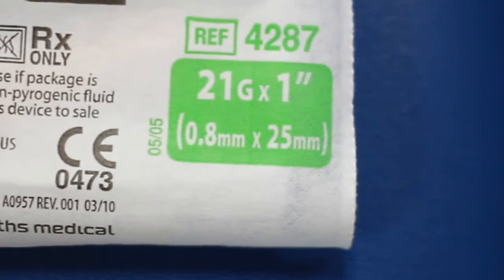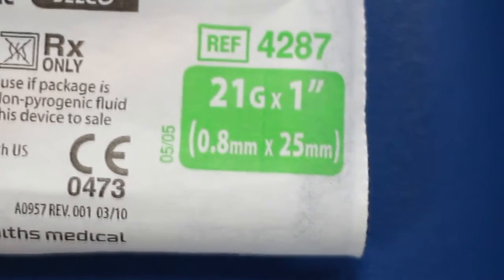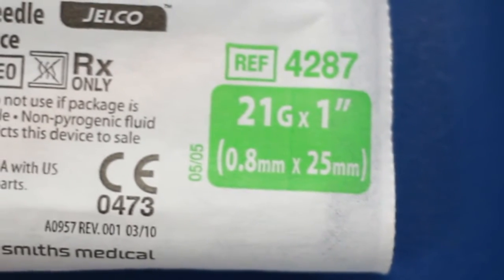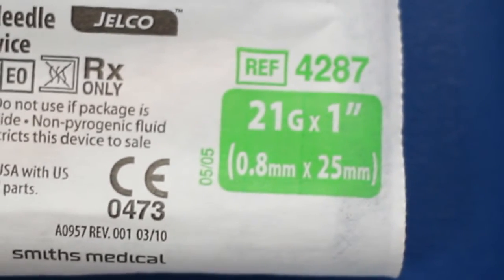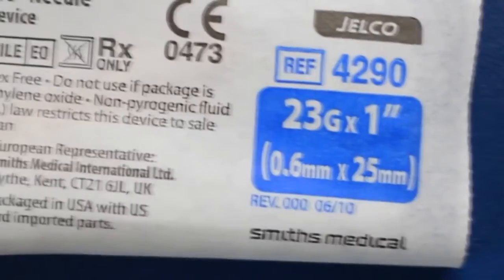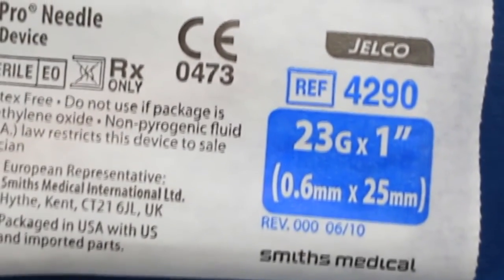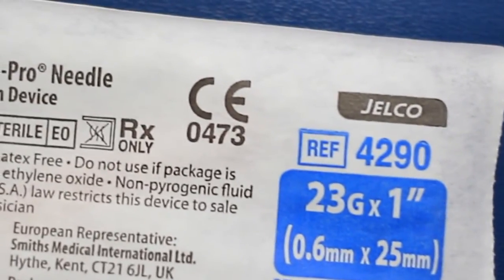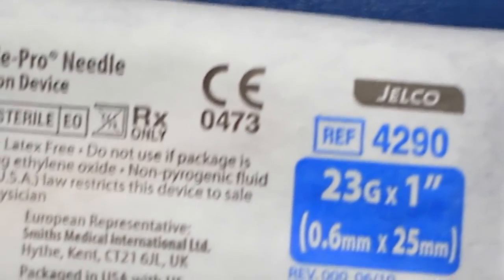Shown here is a 21 gauge, 1 inch needle. This is the largest standard needle utilized by phlebotomists. Note that the labeling is printed in green for easy identification. This is a 23 gauge needle, 1 inch in length. It is the smallest standard needle utilized in phlebotomy. The 23 gauge needle is printed in blue for visual identification.